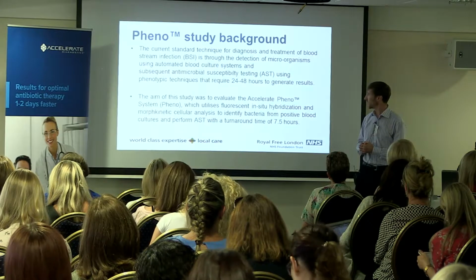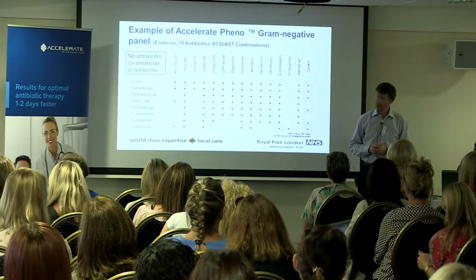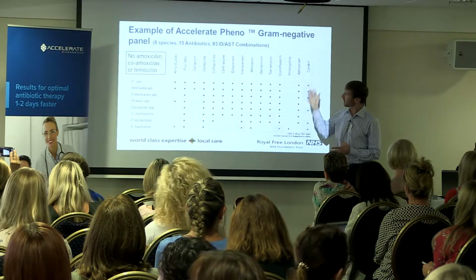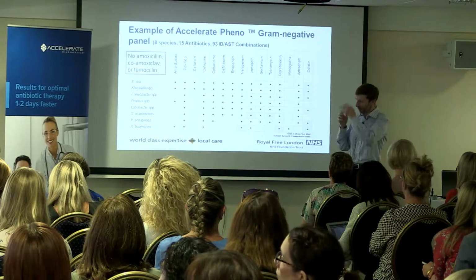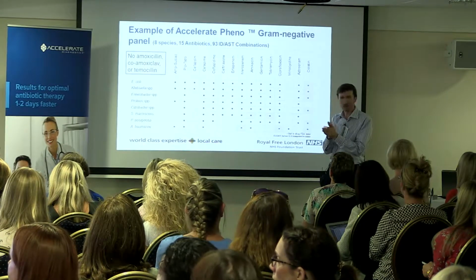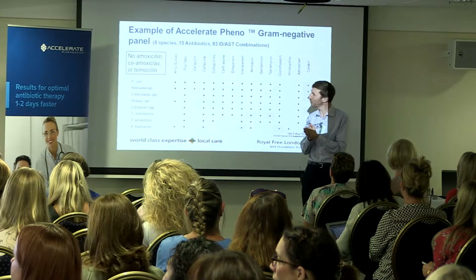So we wanted to see how accurate this was across a range of test organisms. The antibiotic panel is across the top here, if you can read sideways. And this is useful for most of our antibiotics that we use, although of note for us in the UK, the panel at the moment doesn't contain amoxicillin, which is quite good when we focus down the antibiotic use. If we want to target and use narrow spectrum, we like to narrow down to amoxicillin.